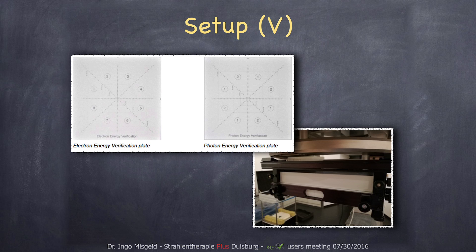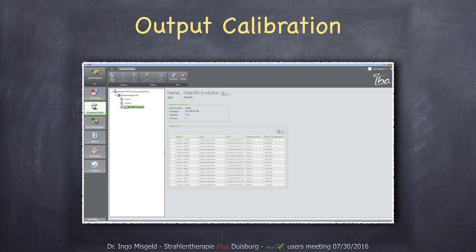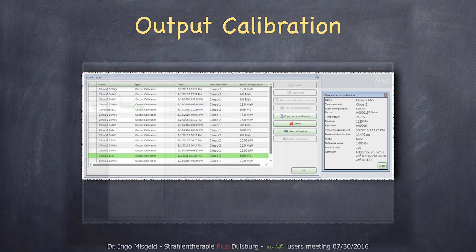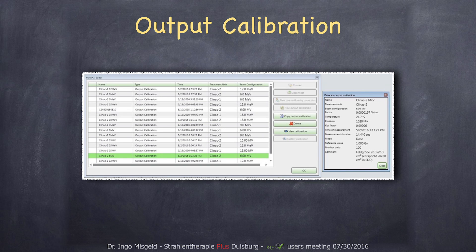The first thing you start with is the output calibration of the detector. It's done in myQA under the equipment setup. There you have your detector and you can add an output calibration, which is pretty simple. You can define how many monitor units you irradiate the detector with and what the corresponding absolute dose is supposed to be. Everything like temperature and pressure correction is recorded as you do the calibration.